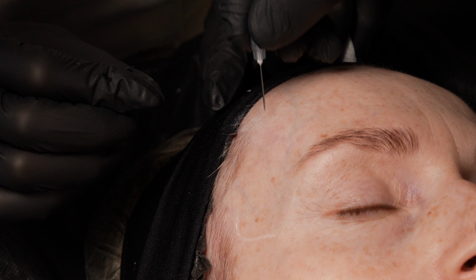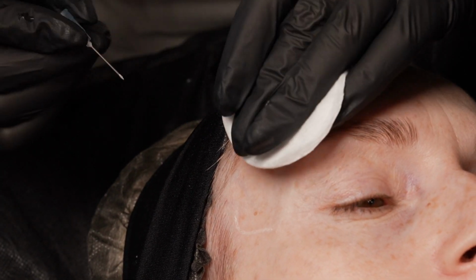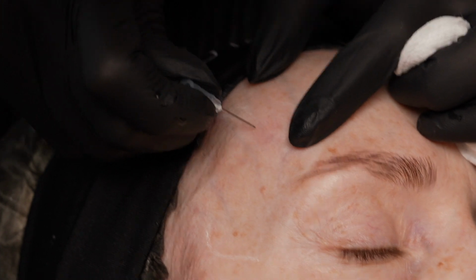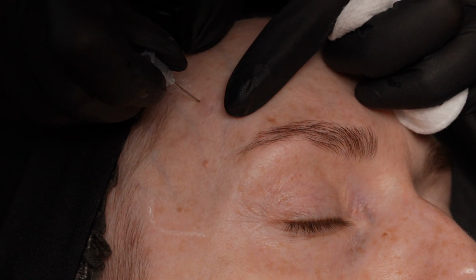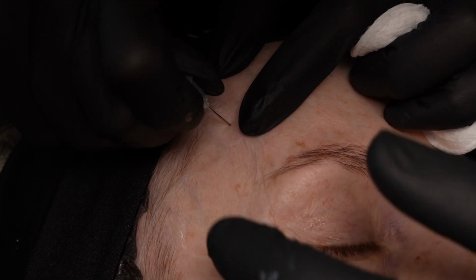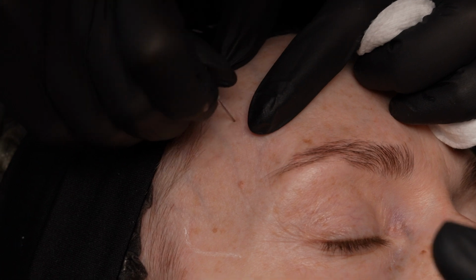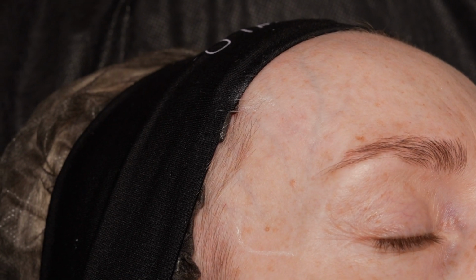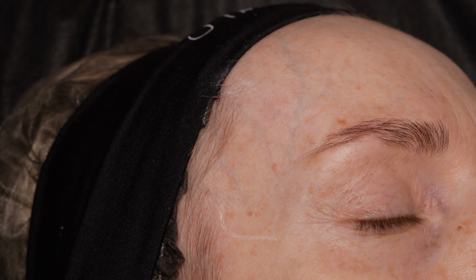Here, no, not a vein. Touch the bone. Directly open the vein. That's all. Make it like this to open. Yes, good. I think that's enough. Let's see. So, thin tissues.